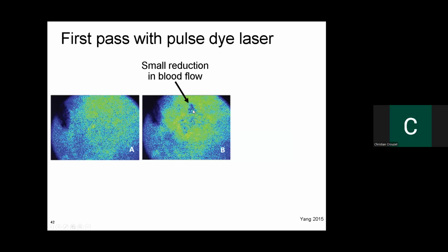Now, one thing I would like to mention is that the clinician was not able to look at the laser speckle imaging during treatment. They did complete normal standard of care. So these measurements were taken more as, let's see what the clinicians do and how that correlates with the outcome. Yes.